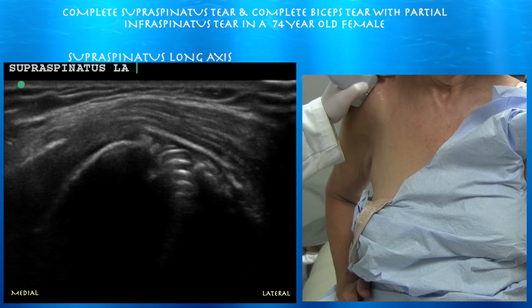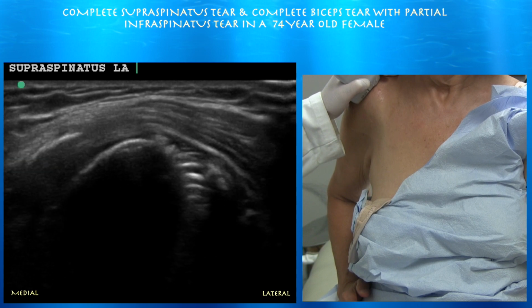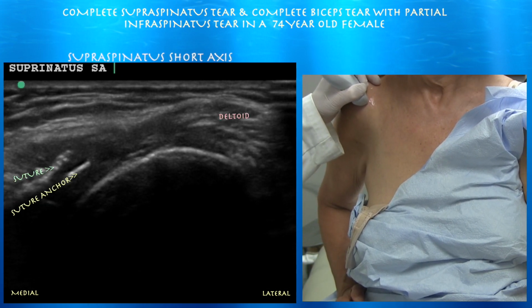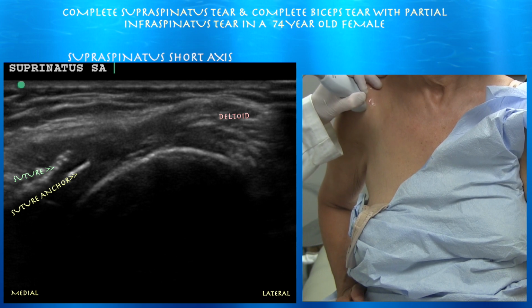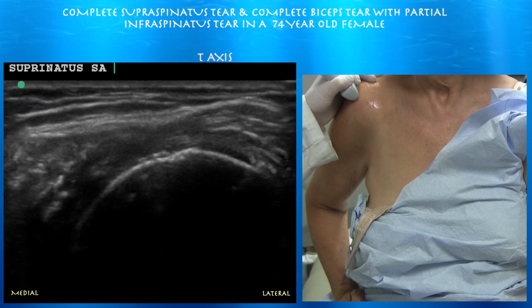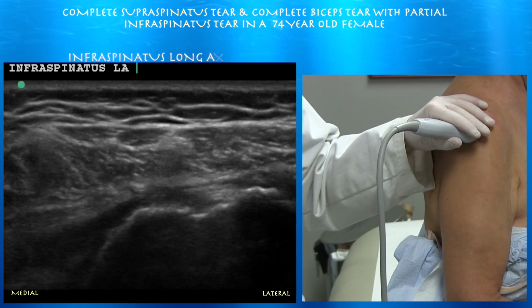And I believe that suture anchor is kind of right near the surface. I believe it may have pulled out. You can see just a long suture here. And also you can see a bright straight line consistent with a pulled out suture anchor. And then we go down, we got suture material. So right side of the screen is lateral.